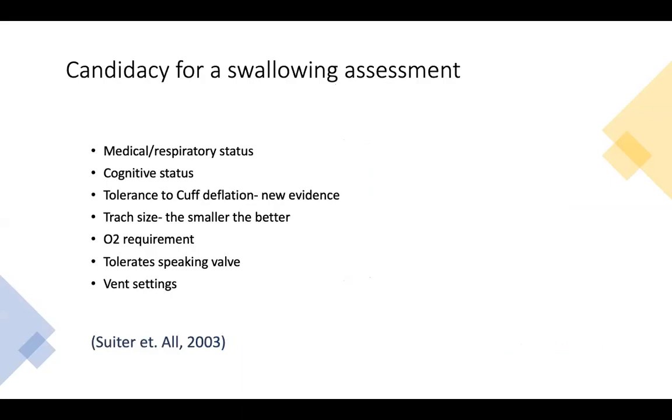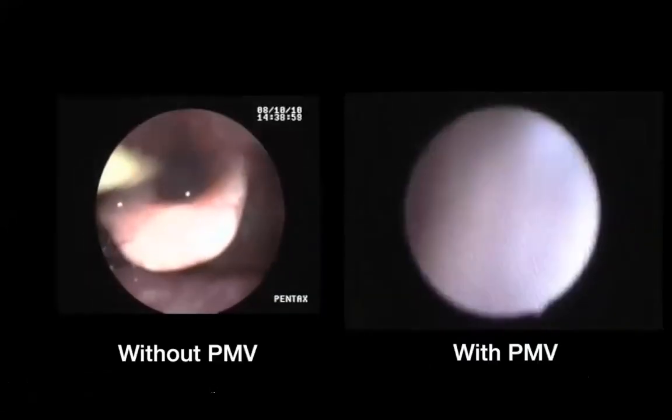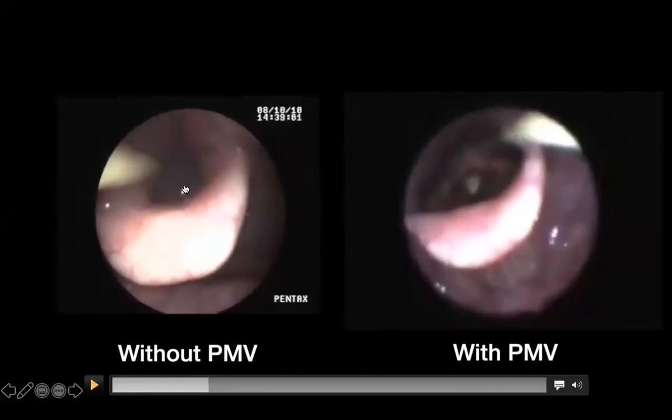Last thing, I just wanted to show you a video of both assessments: FEES with speaking valve and without, and modified barium swallow with speaking valve and without. This is a short video, but I want you to pay attention to the without.